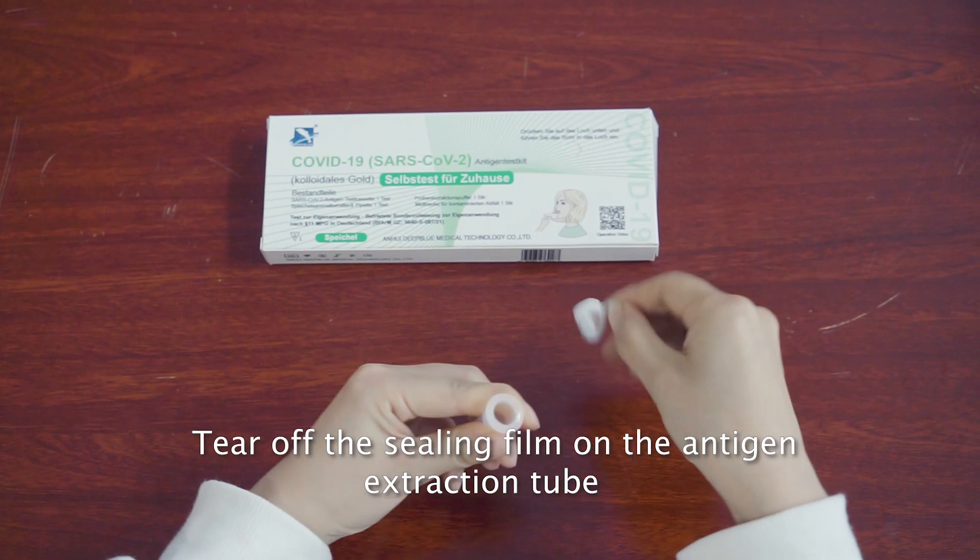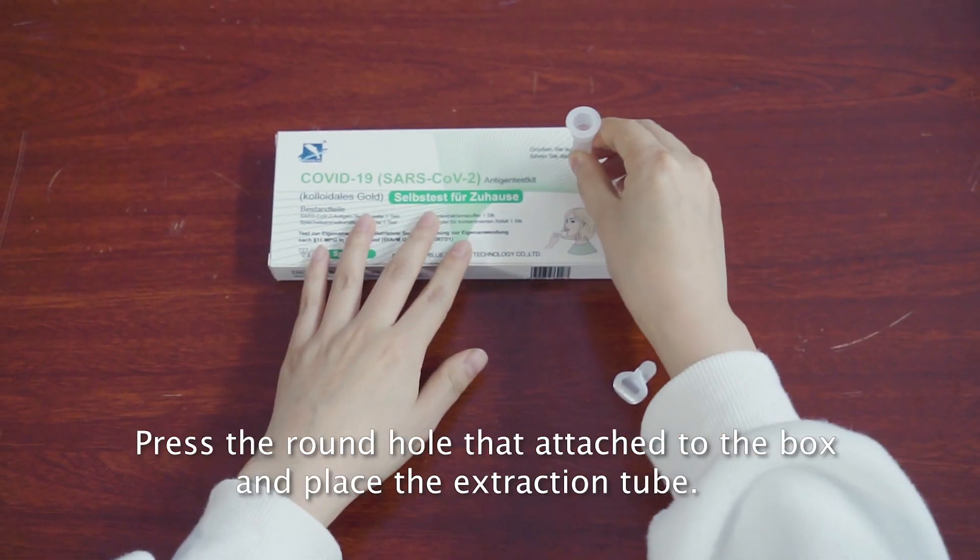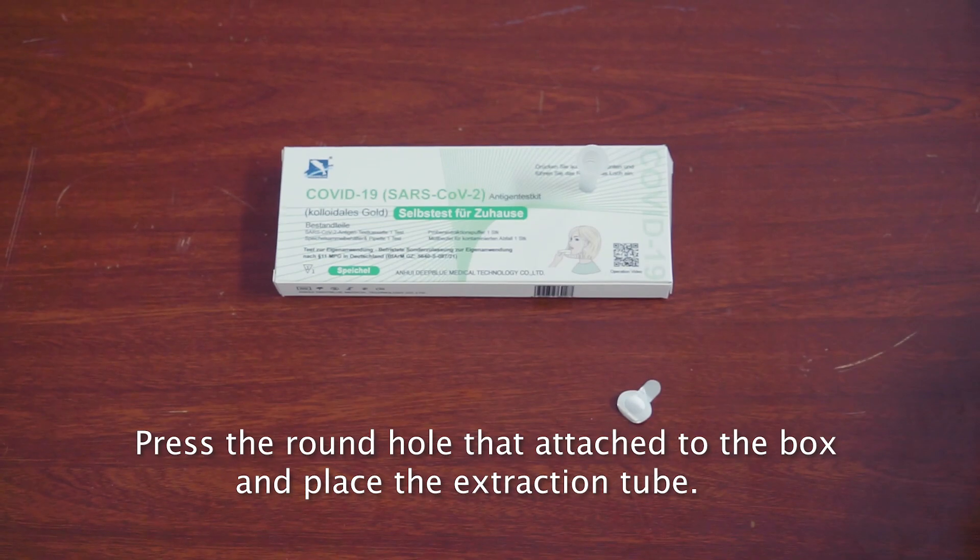Tear off the sealing film on the antigen extraction tube. Press the round hole that is attached to the box and place the extraction tube.